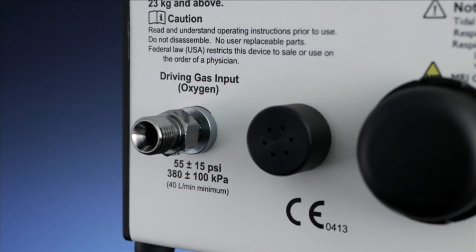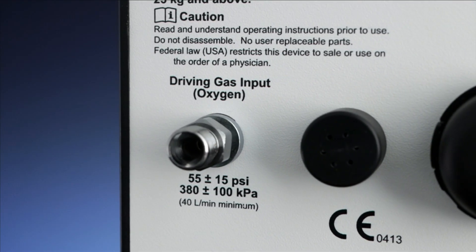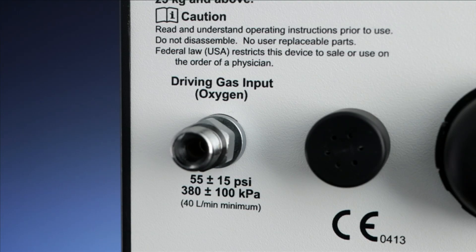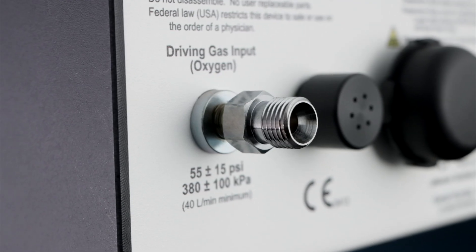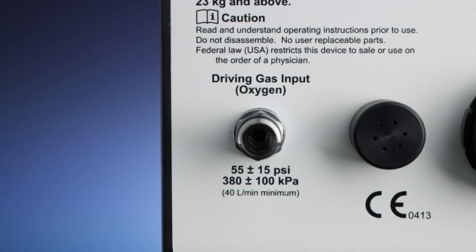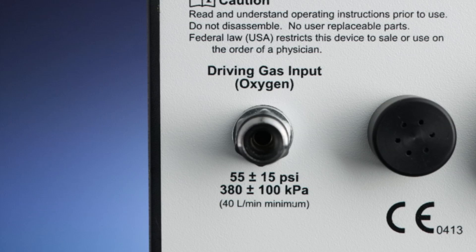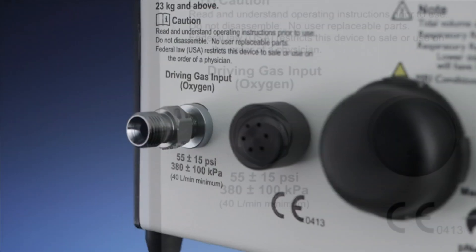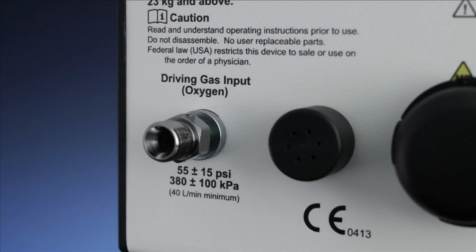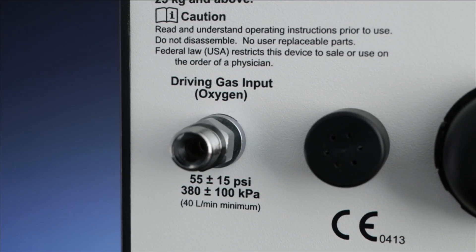Driving gas input connection. The first item on the rear panel is the driving gas input connection. Keep in mind the Newton A does not require electricity or batteries. Instead, the device runs on the hospital's high flow oxygen source or portable compressed oxygen cylinder and requires 55 psi with a minimum flow of 40 liters per minute. Always ensure that the gas supply line is secure and operating at the proper pressure. Note that when the gas is first connected and flowing, the ventilator will alarm — this is normal. The ventilator will begin to function at the preset values.